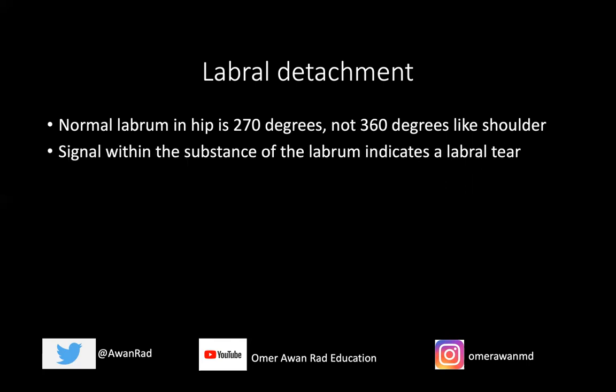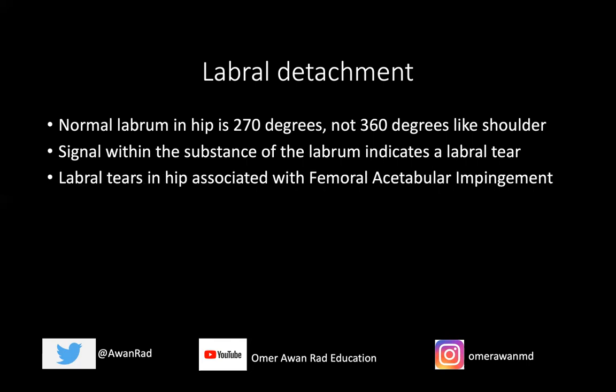If you see contrast going into the substance of the labral triangle itself, that indicates a labral tear — which is not what we saw on this study. What we saw here was a labral detachment.